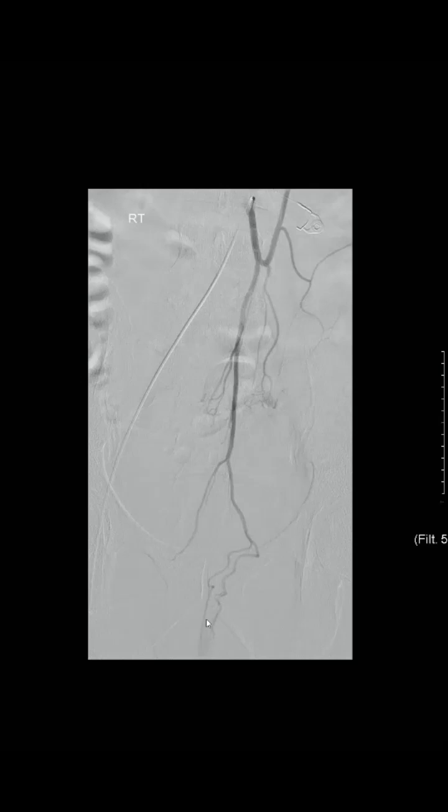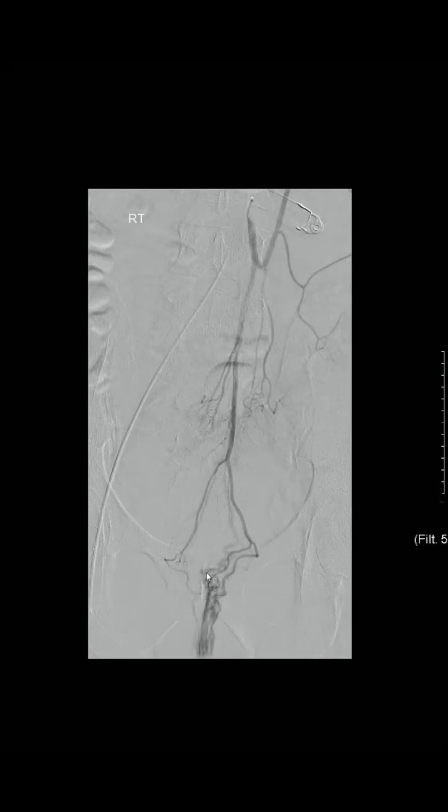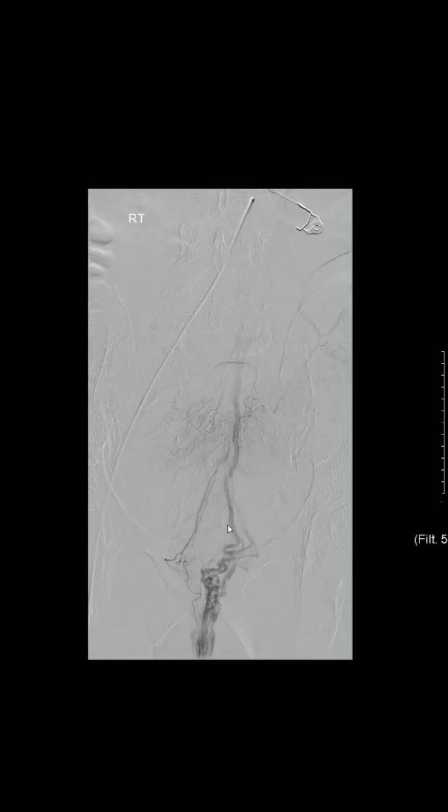The distal vasculature of the hemorrhoidal arteries we can see opacify the hemorrhoidal cushions and the mucosa of the rectum. But then eventually we see these large tortuous hemorrhoids. These internal hemorrhoids are what are causing the bleeding in this patient.